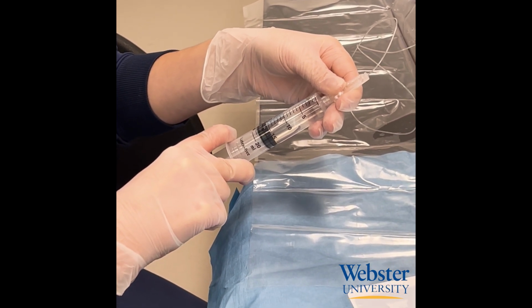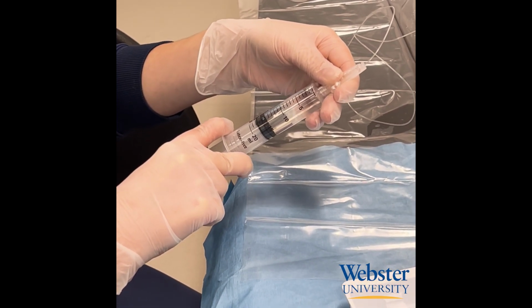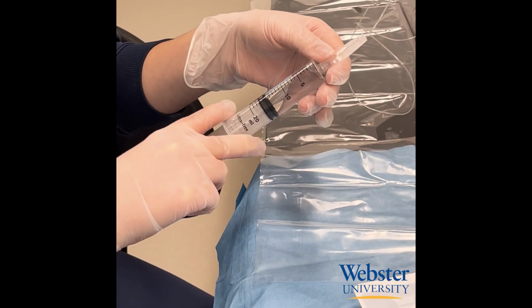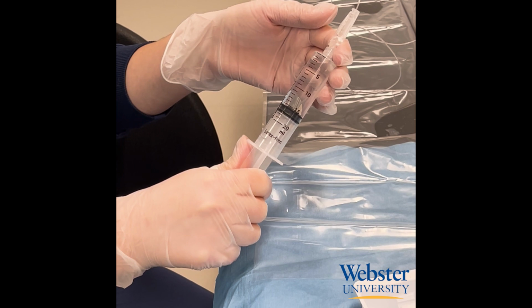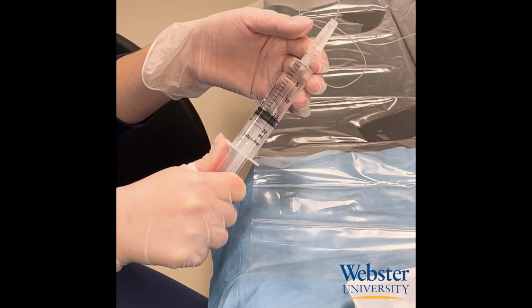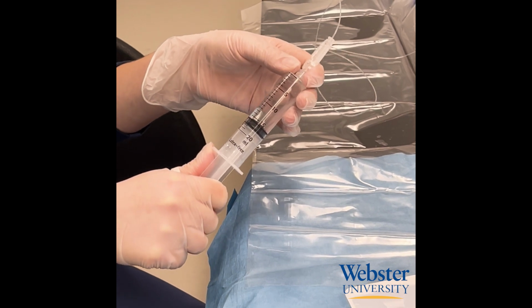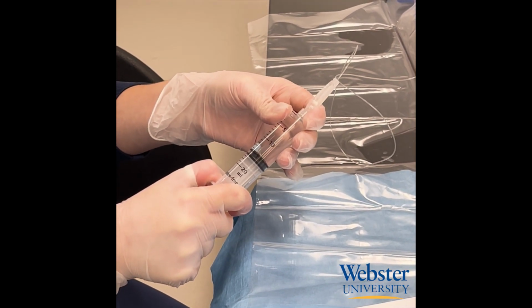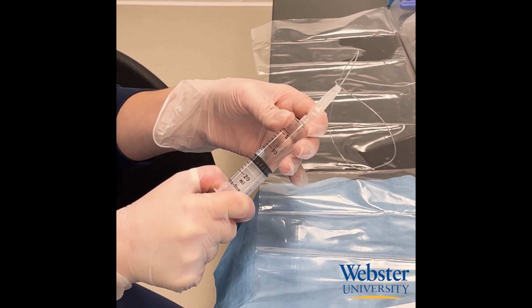Once 5 mL are in, then another aspiration attempt should be made because the catheter may have migrated after the bolus. Then you can bolus another 5 milliliters. You can always aspirate more often, like every 3 mL, but you have to do it at least every 5 milliliters at minimum for safety.